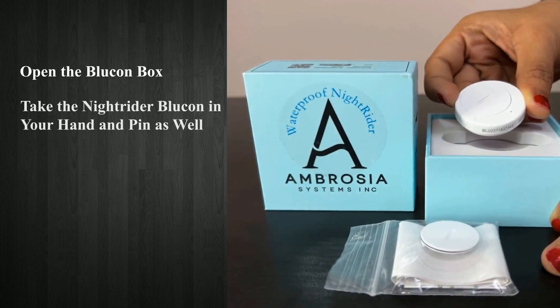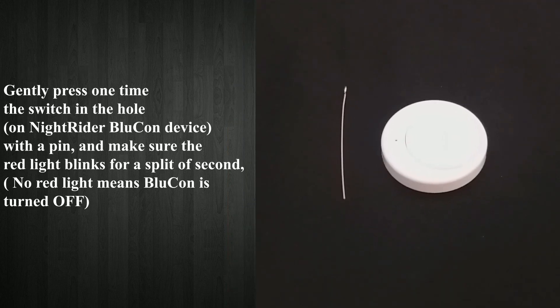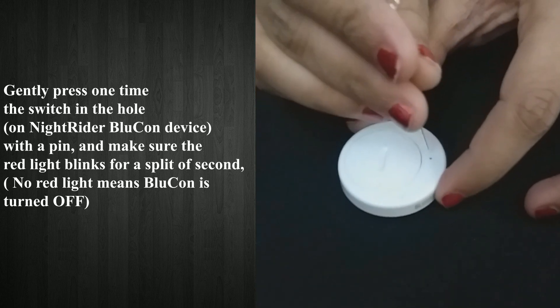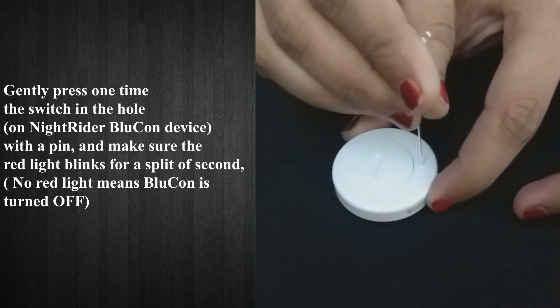Open the Blucon box and take the Nitrider Blucon device in your hands along with the pin. Gently press the switch in the hole on the Nitrider Blucon device with the pin once, and make sure the red light blinks for a split of a second. No red light means Blucon is turned off.